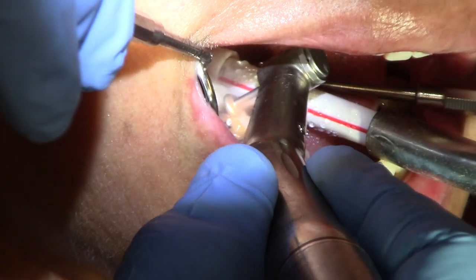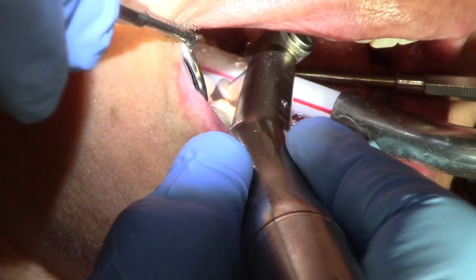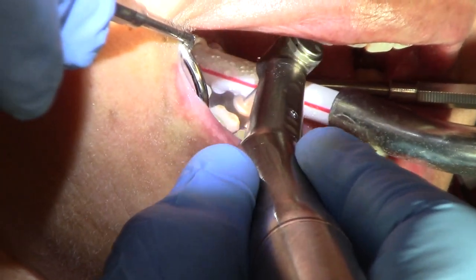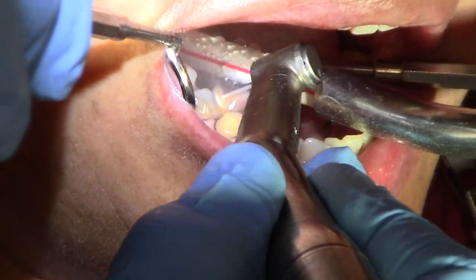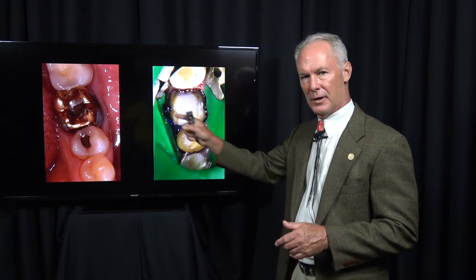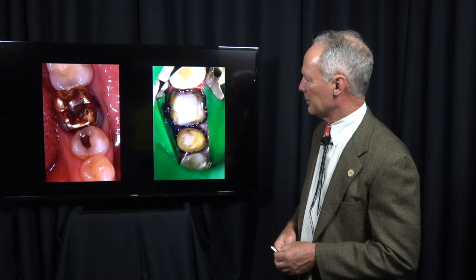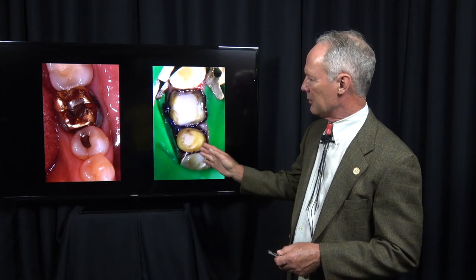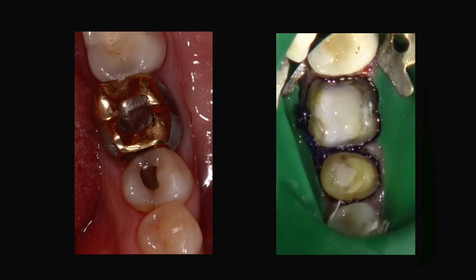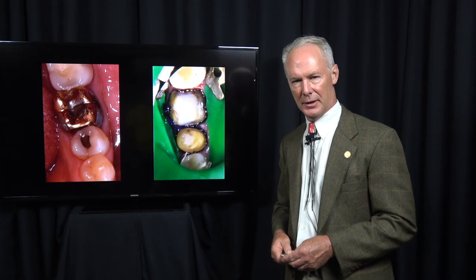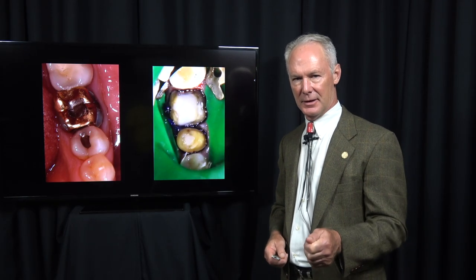Be sure you've got at least a millimeter and a half of clearance. Crown removal from a mandibular first molar tooth, and crown preparation of a mandibular first molar and second bicuspid with composite build-up placement. And that's the Dental Minute.